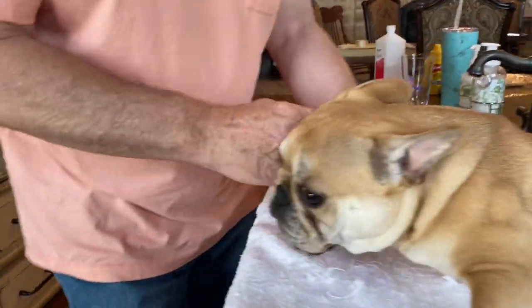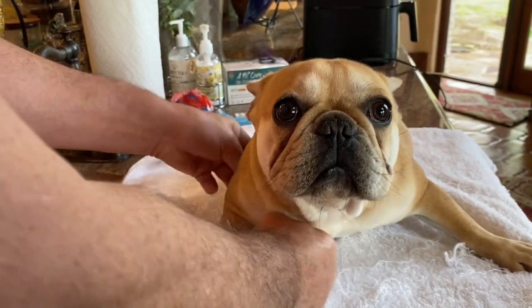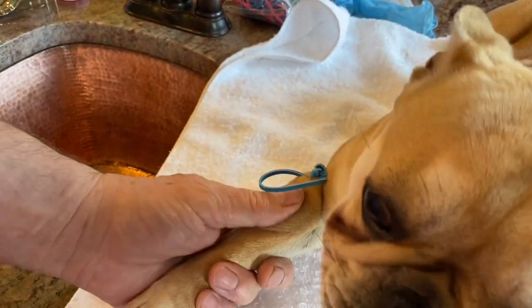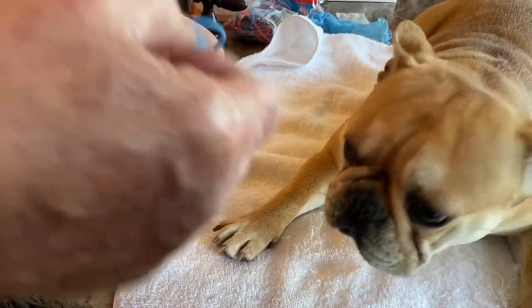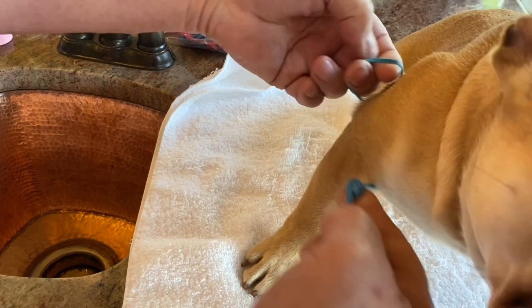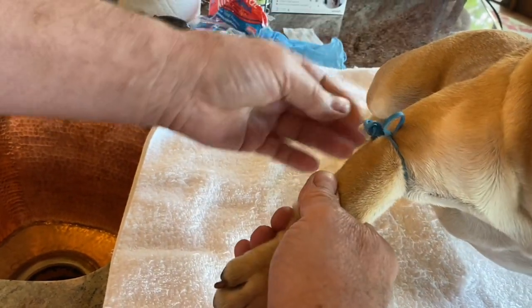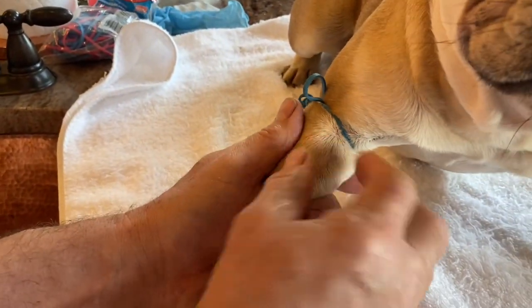Come over this way here, Tammy. So here it goes — I'm taking this and painting it through the knot like that. That's it. That's the tourniquet. And the beautiful thing about this is, look, one pull and it comes off. It's so easy. So here we go again. I take the knot, grab the knot through it, get it where I want it, and just let it go.